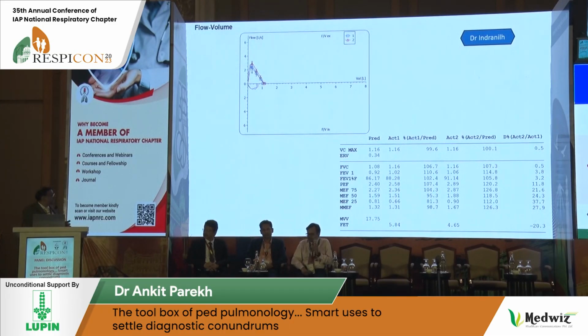Yeah. So we have a forced expiratory time here at the end. So it's around 5 seconds and 4.65 seconds. It is written there, forced exhalation time. So this spirometry was normal.